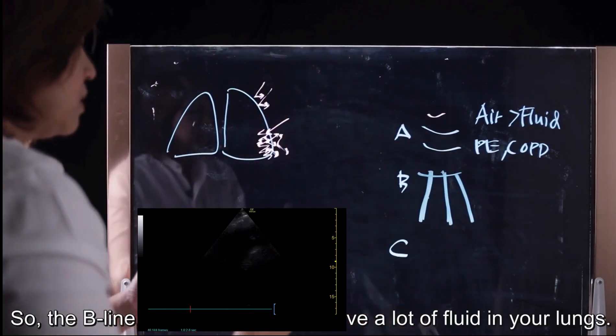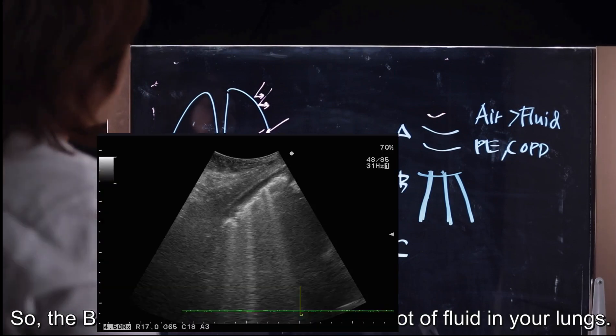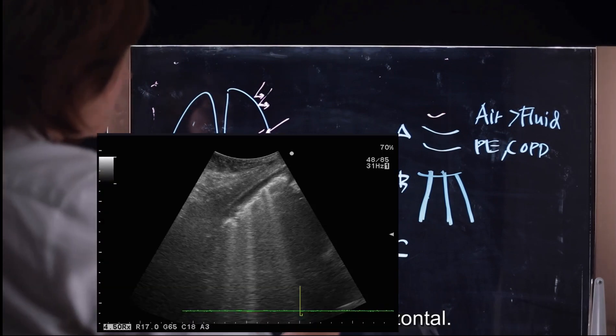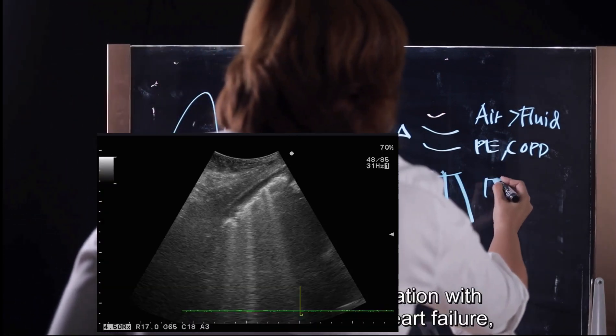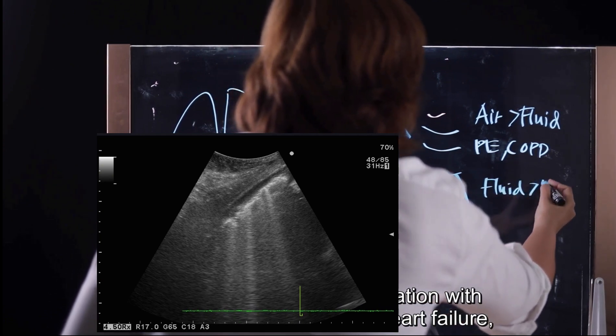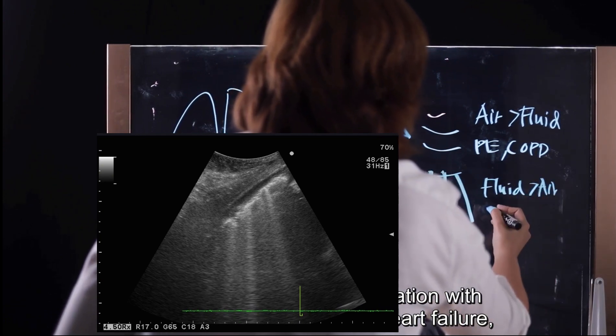So B-line happens when you have a lot of fluid in lung, and it's vertical, it's not horizontal.